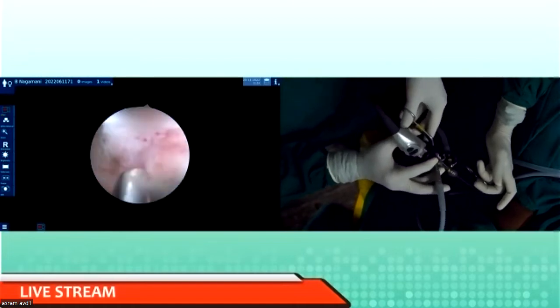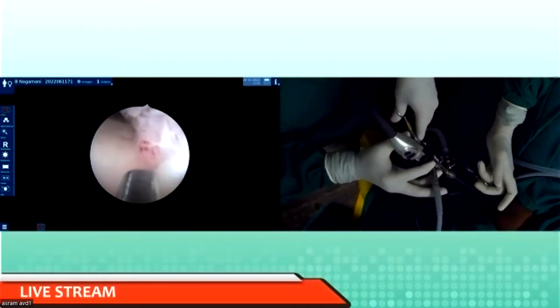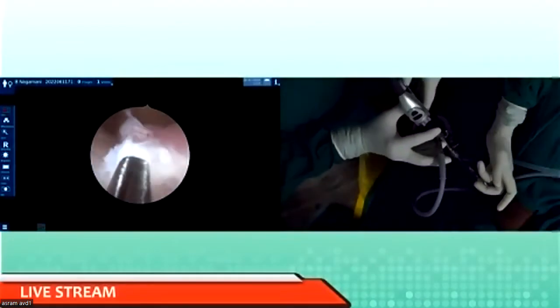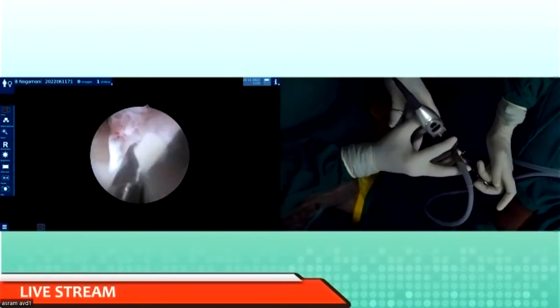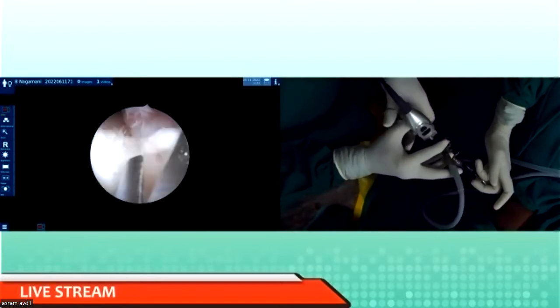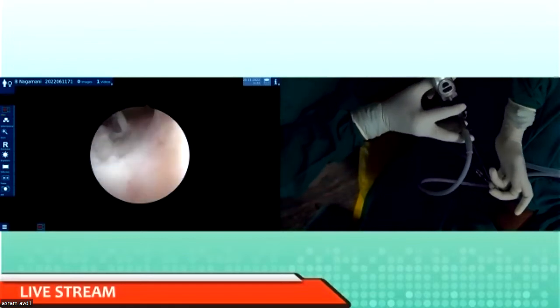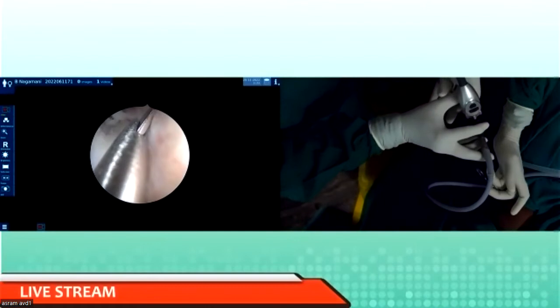And I'll also show you the Bertucci needle. Bipolar unte neeku generator atu undiga. So I'll show you how to do it with the scissors. Okay, sir.